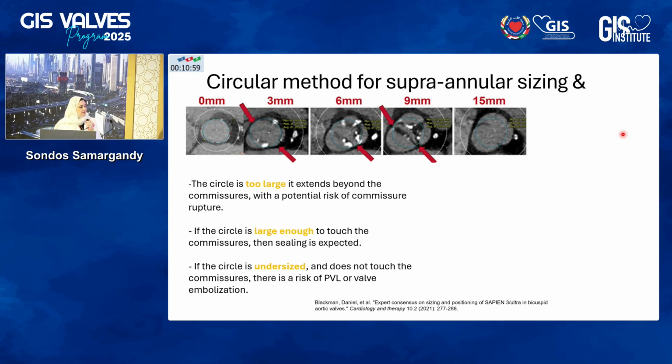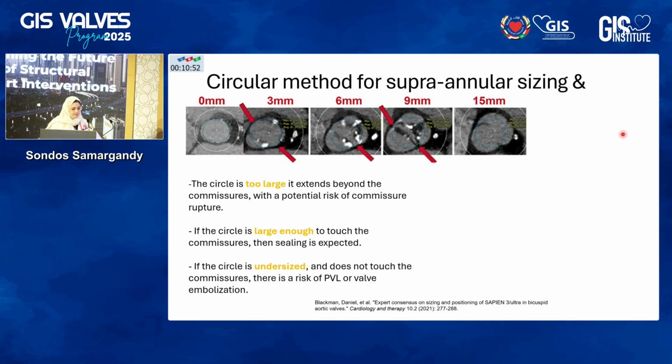What do you think, Dr. Ahmed? Do you use it usually? So this is like as if you are putting a virtual valve, and if the ring, you put it at the left, and we do this.